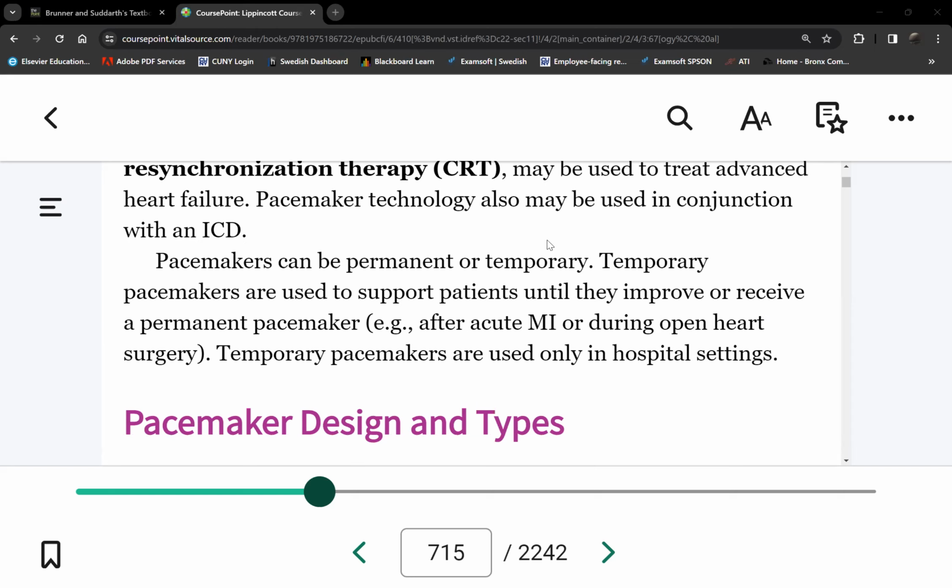The temporary pacemaker comes in 2 forms. So it's either transcutaneous, meaning over the skin, or transvenous, wherein the device is outside her body. However, the wires are inside her heart. Let's look at the first, transcutaneous type first. The equipment used there is the same defibrillator we use for cardioversion and for defibrillation. Same LifePak defibrillator. Same pads we use as if we were defibrillating her.